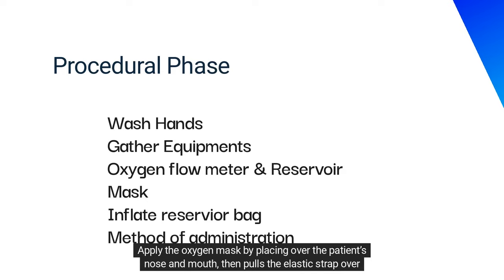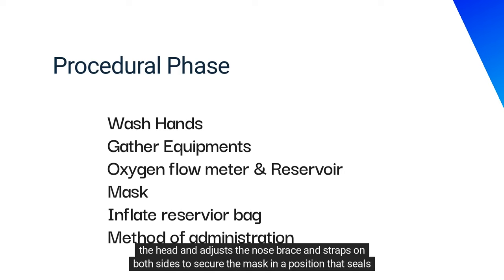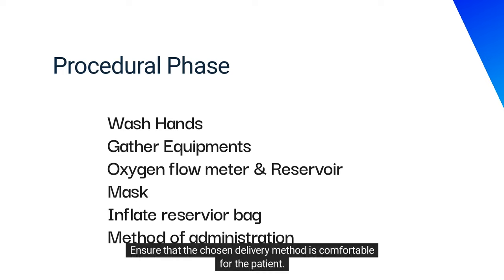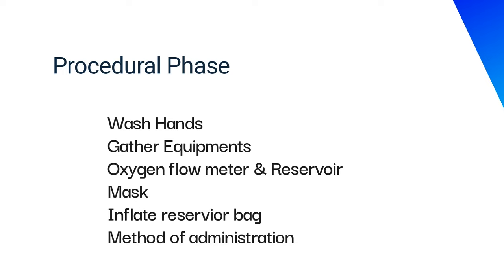Apply the oxygen mask by placing it over the patient's nose and mouth, then pull the elastic strap over the head and adjust the nose brace and straps on both sides to secure the mask in a position that seals the face but is not too tight. Ensure that the chosen delivery method is comfortable for the patient.